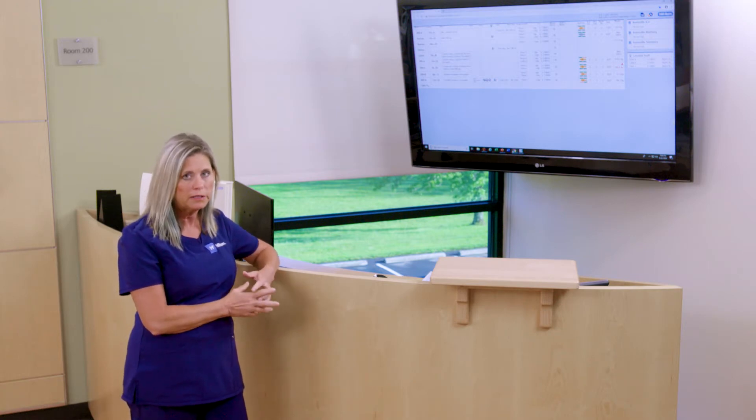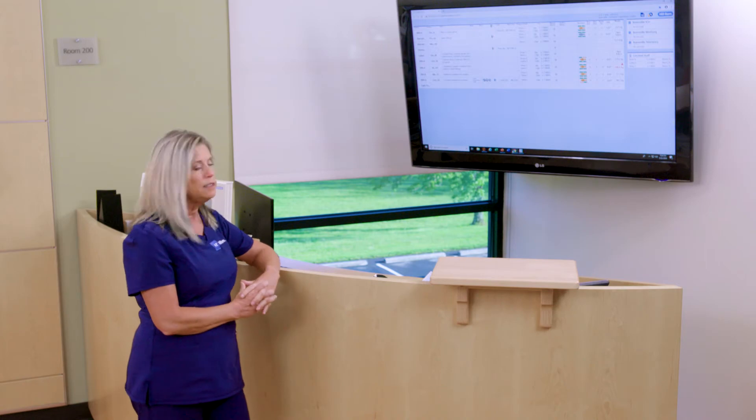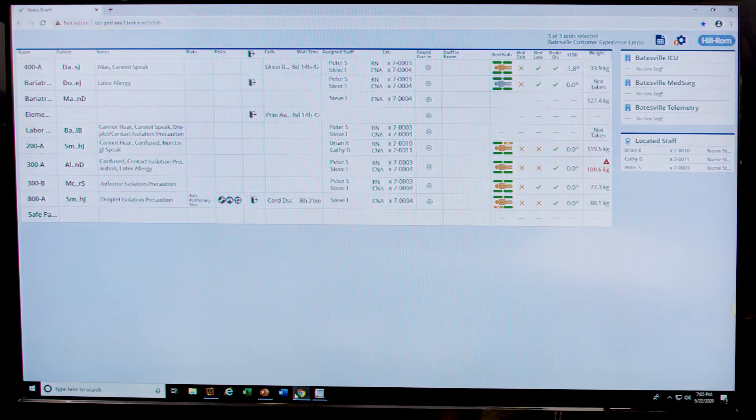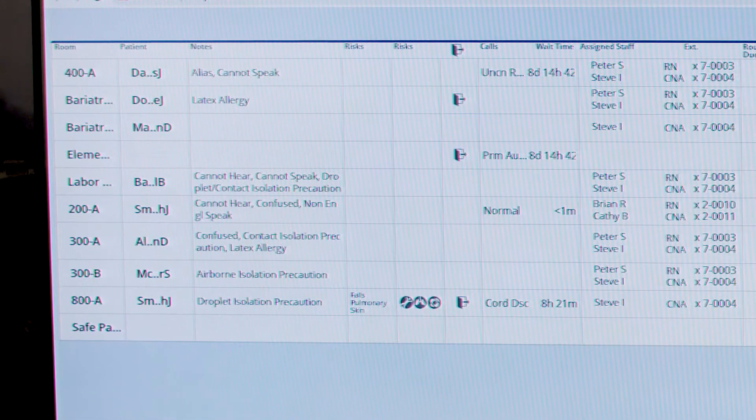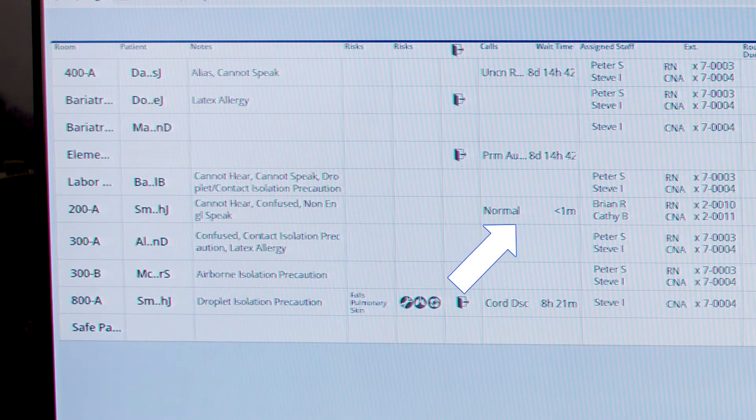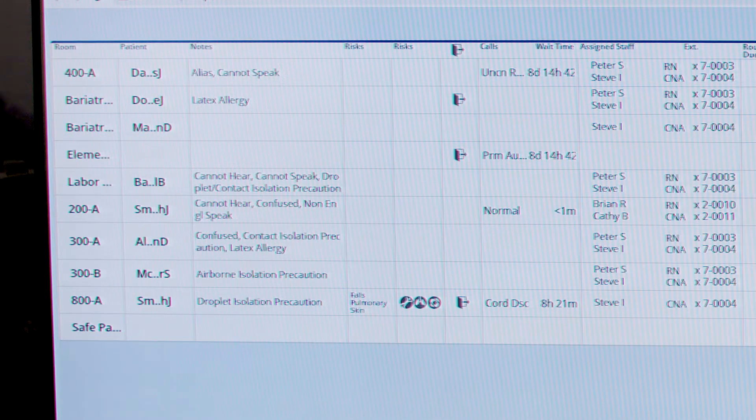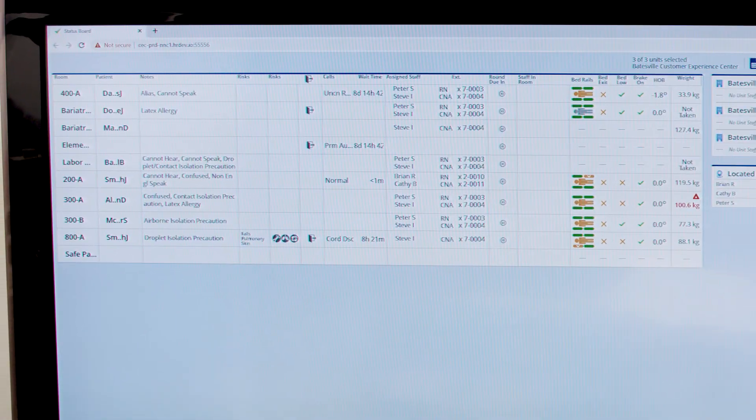A patient places a normal call. We can see under the call column we have a normal call, as well as the active wait time for that patient.